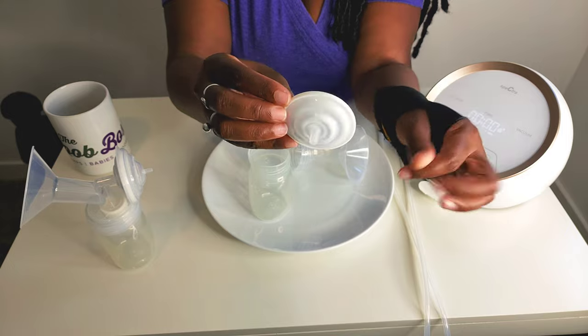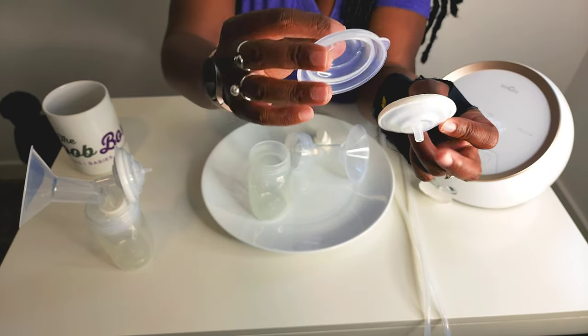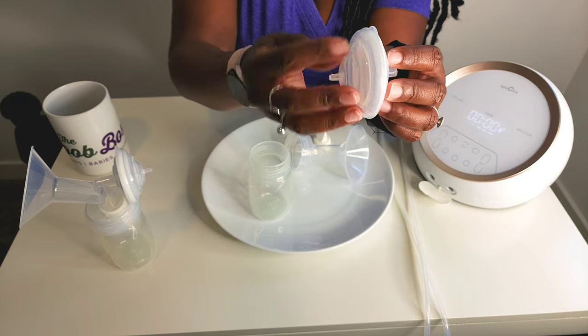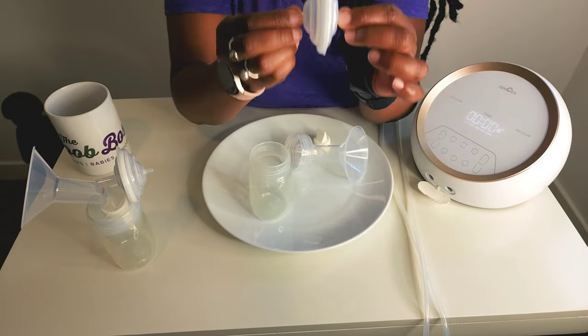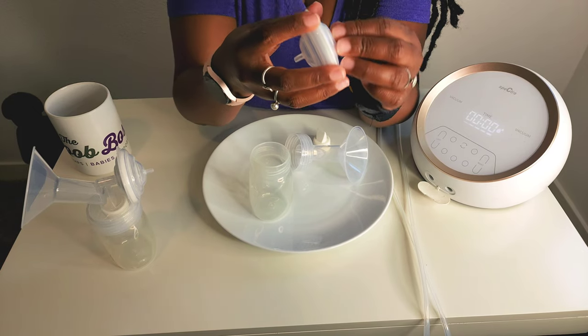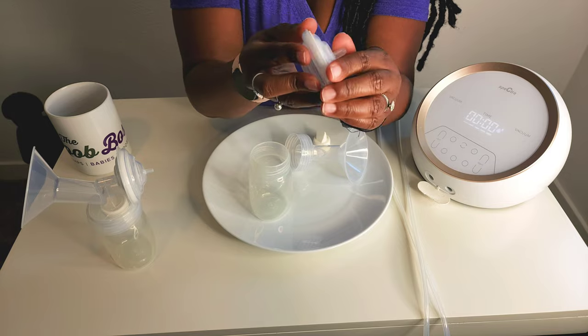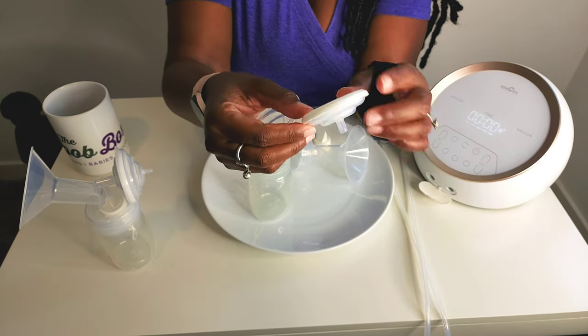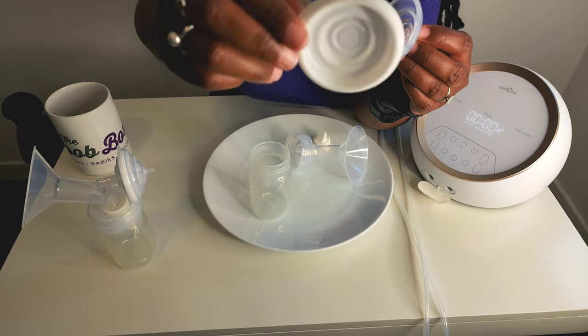Once you've done that, then you want to take the bigger piece, the bigger backflow protector, and then you are going to just cup it in there. If you do it the other way around, it does not hold. It doesn't stay on. You also want to be very careful. Always check. See, now it's on really tight. You also want to make sure that you check the integrity of your backflow protector.